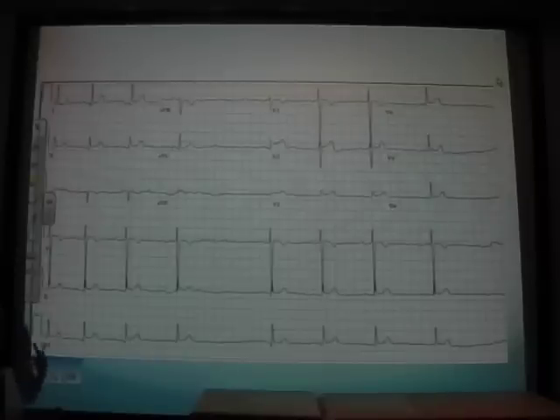When you're commenting on rhythm on an ECG, you have to comment what the actual rhythm is. So is it AF? Is it heart block? Is it sinus? Heart block. What kind? Second degree. Any takers? Anybody want to agree, second to third? Maybe it's type 1. Brilliant. Well done. So it's maybe type 1 second degree heart block.